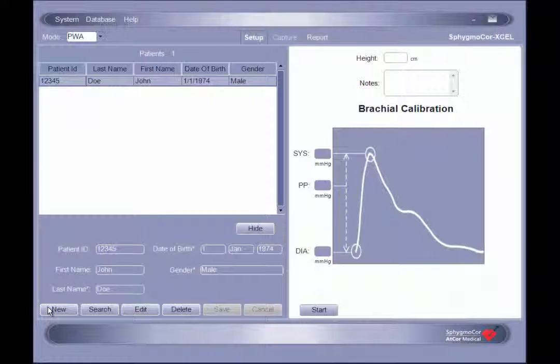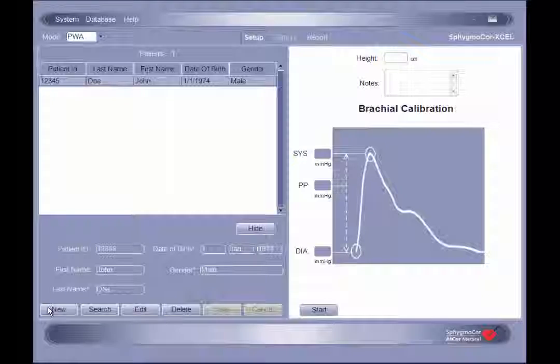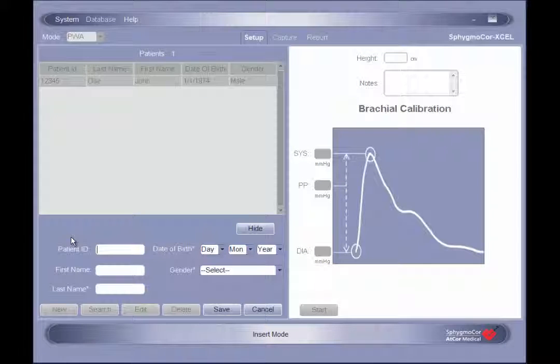If the patient has already had a profile created in the SphygmoCor XCEL software, locate that profile in the patient list and then proceed with the assessment initiation. To create a new patient profile, click New in the lower left-hand corner of the setup screen and enter the patient information into the appropriate fields.